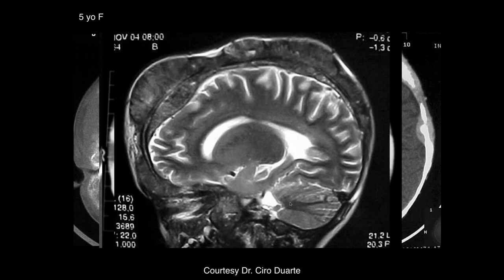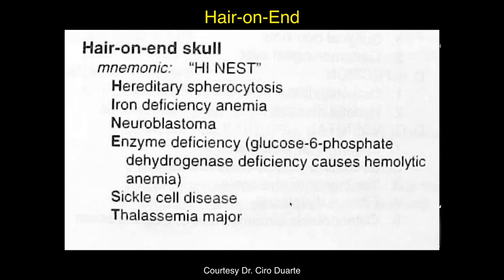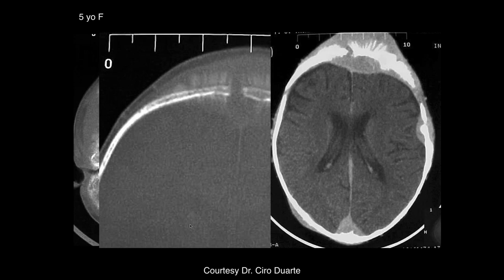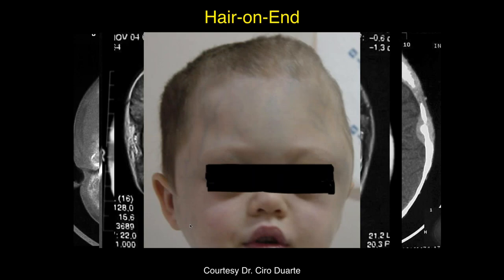Here's what it looks like. It looks much more diffuse here. Yes, that might be a soft tissue component. And here's really the differential: hereditary spherocytosis, anemia, neuroblastoma, enzyme deficiency, sickle cell, and thalassemia. And this was neuroblastoma. This is too diffuse also. No, this is just hair on end. For a skull lesion to look like this, you could certainly put that on the differential, though this wouldn't be a common location for it.